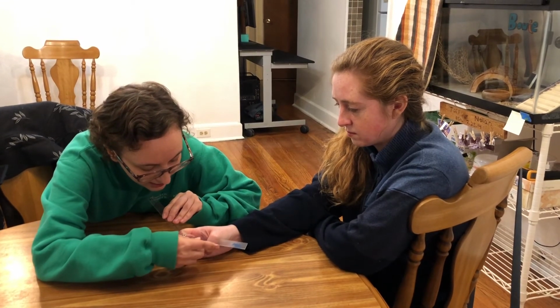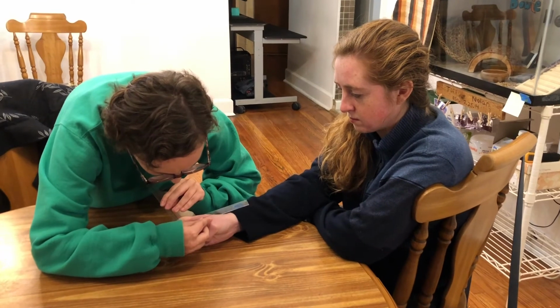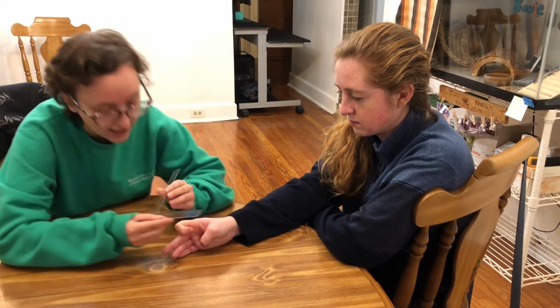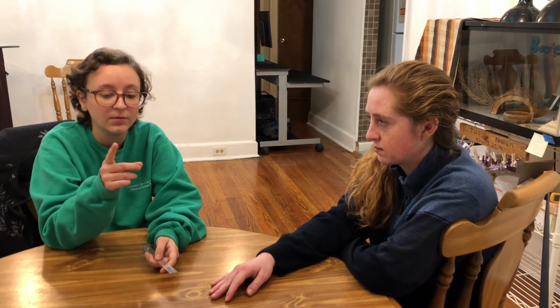I'm gonna go ahead and measure. I'm gonna stand up to get a better view. Fantastic, we're getting about 79 degrees of DIP flexion. And this is goniometer measurements of the MCP, the PIP, and the DIP joints.